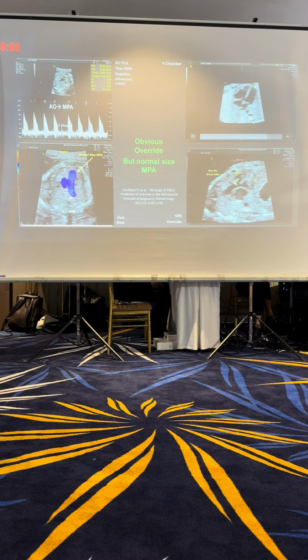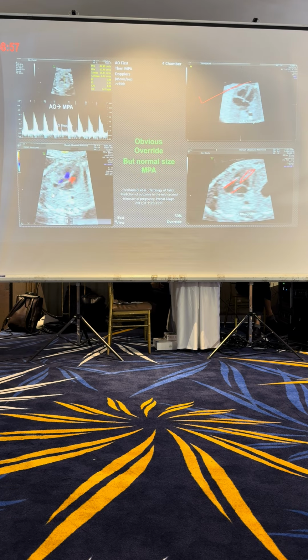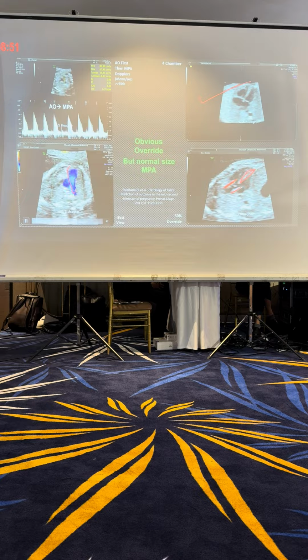The four-chamber view looks normal. When I look at the five-chamber view, I can see there's very obvious aortic override. And I say to myself, this looks like tetralogy of Fallot. I say, well, hang on. When I sweep from the five-chamber view to the three-vessel view, I see a pulmonary artery that looks normal. Laminar flow, aorta as we see, and the pulmonary artery is bigger than the aorta, as we see.